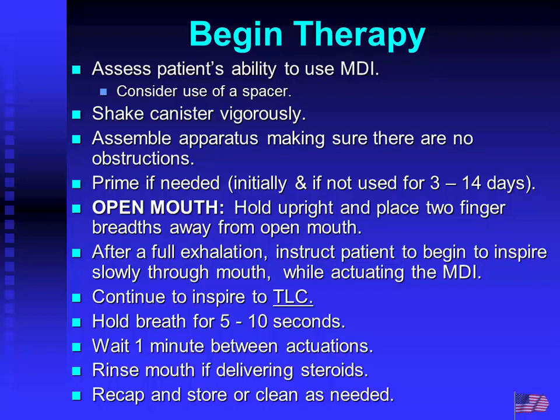Making sure that there's no obstruction, so if it's one where you have to take a cap off and put the thing together, you want to make sure that there's not anything that could potentially be inhaled. If it hasn't been used in the last couple days, or if it's a new inhaler, do a couple priming doses.